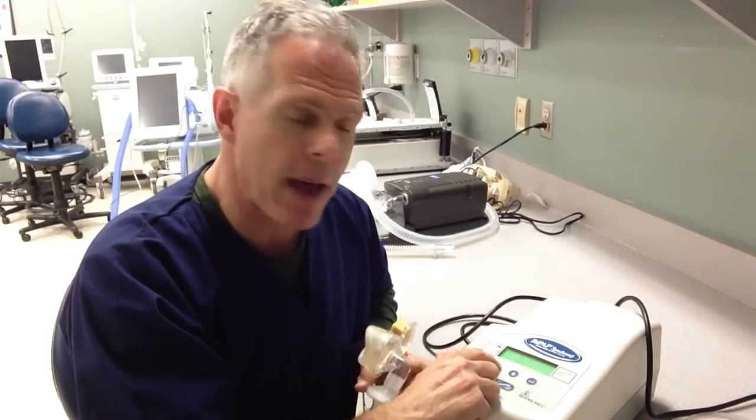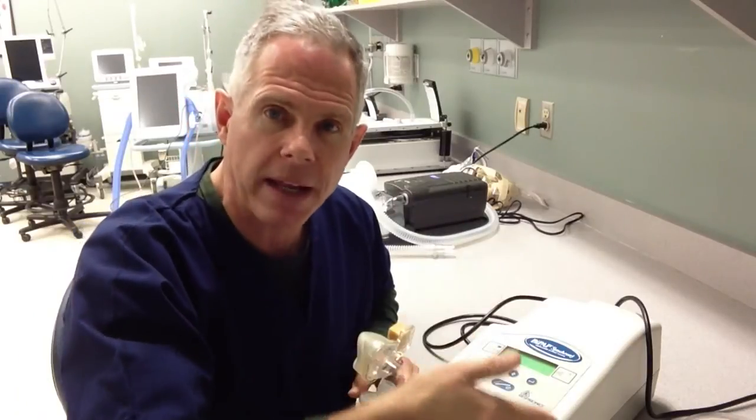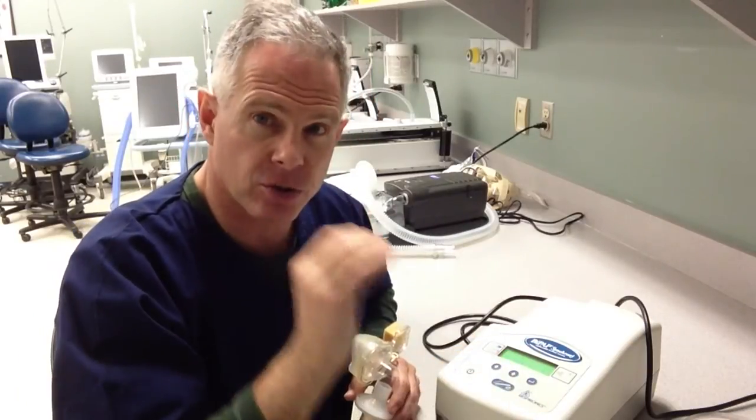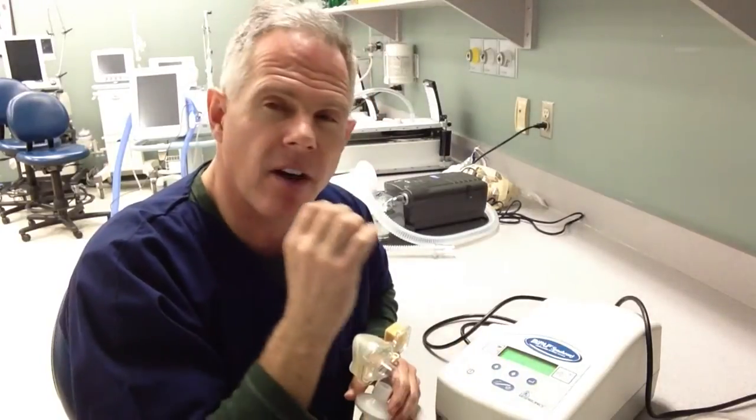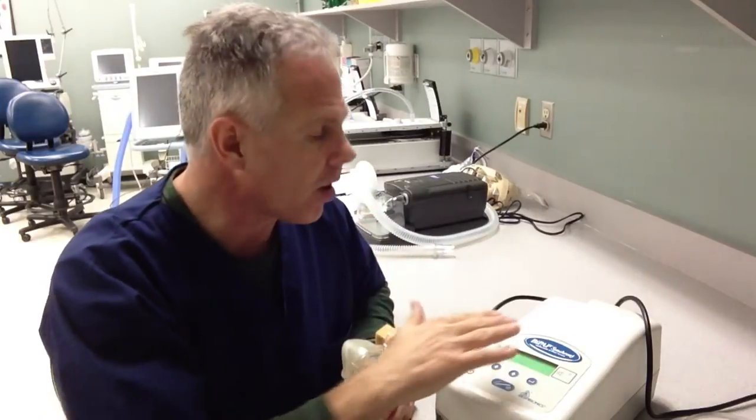The available modes are: CPAP; S for spontaneous, which is the mode like pressure support; ST timed, which allows me to set a backup rate on the ventilator; straight pressure control; and something called the timed mode. We're going to play with and examine the S mode, or the spontaneous mode, which is like pressure support or BiPAP.